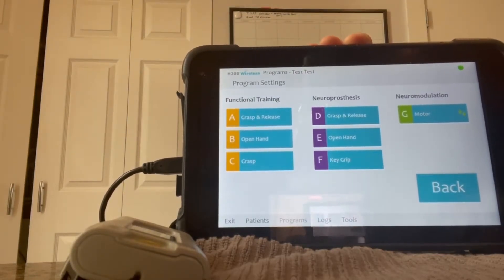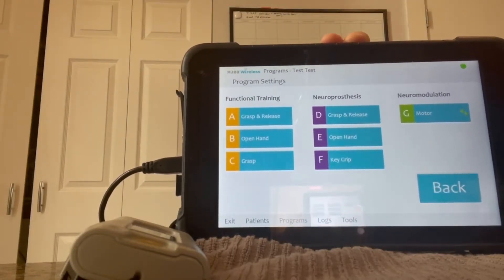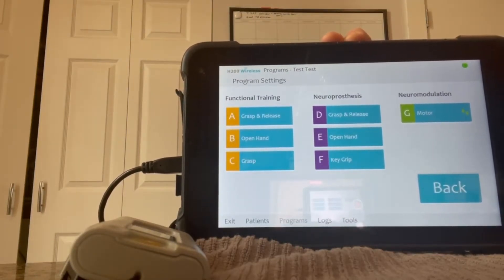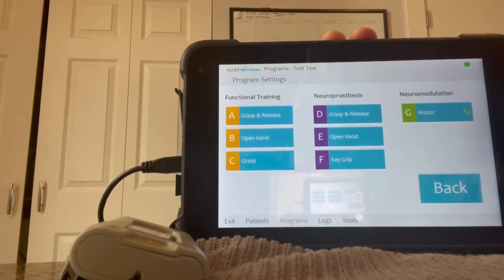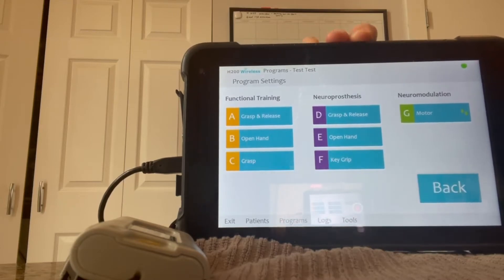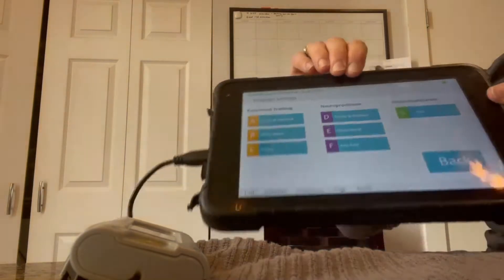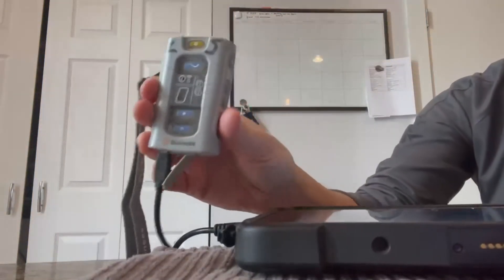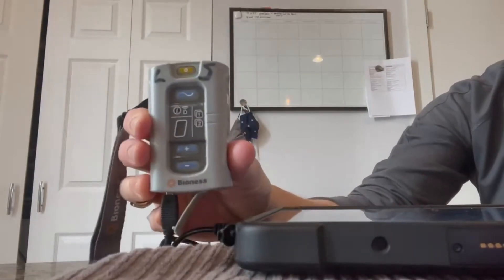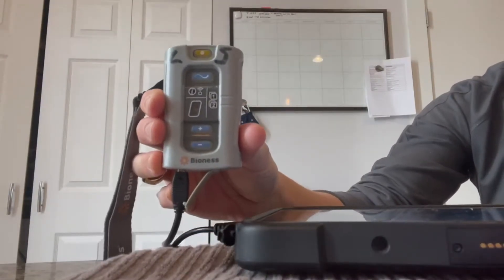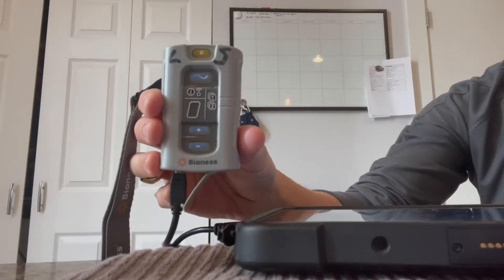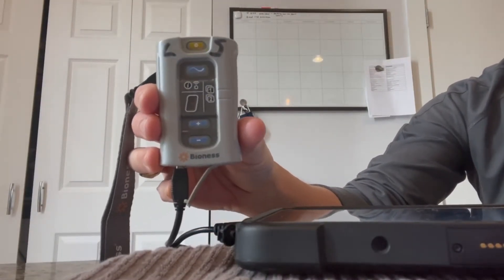As you know, when you're treating a patient with the H200, you can access all seven H200 programs from the Clinician's Programmer tablet. If you chose to, you could also work independent of the tablet using all seven programs from the control unit. I'm going to show you how to do that now.